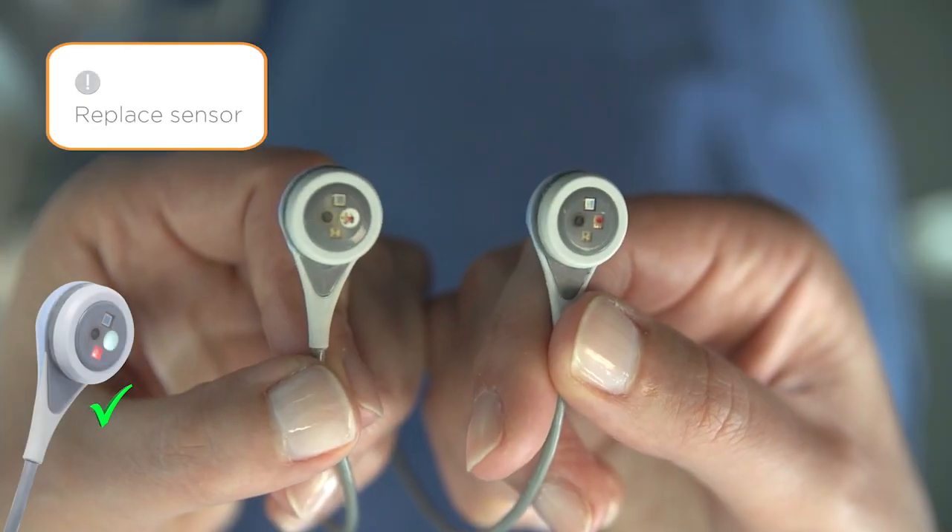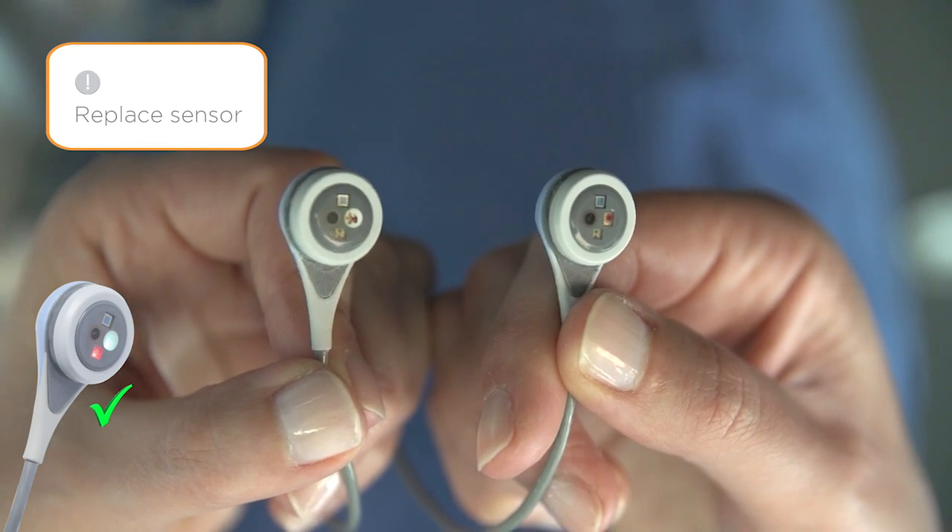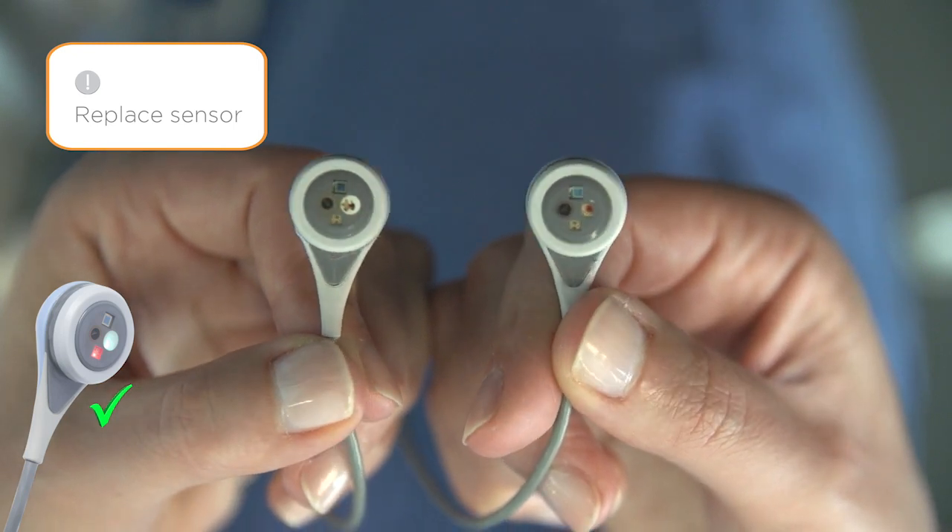In the case of the OxyVent sensor, do not use the sensor if the white spot on the sensor face is missing or damaged.